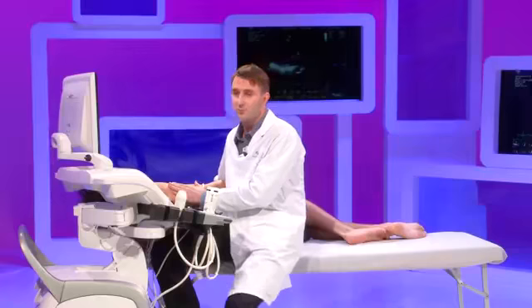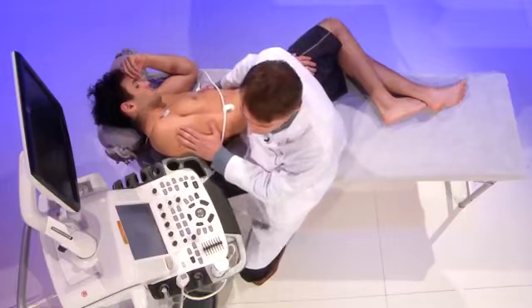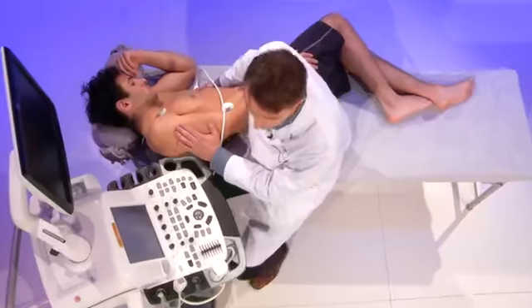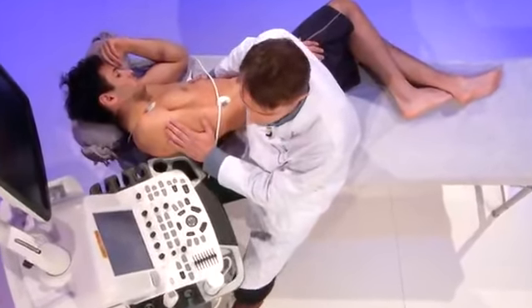The subject of this topic will be how to set up the echo machine. It's very important to set up your echo machine well, to get optimal image quality and to make the right diagnosis for your patient. Before you start an echo, make sure your patient is lying comfortable on the table on his left side, with his left arm up to open up the intercostal spaces, and with his left arm next to his head, not under his pillow, so as not to have muscle tension, because when you have muscle tension, you will have lower quality echo images.